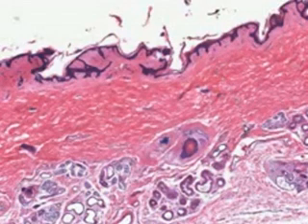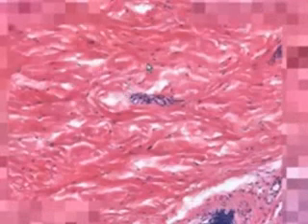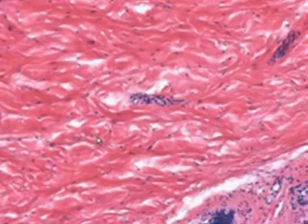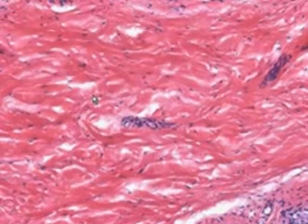The reticular dermis is this thicker, denser collagenous connective tissue in which you can see clearly dense collagenous fibers and fibroblasts. In addition, if you were to do an elastic stain, you would see that the reticular dermis is loaded with elastic fibers, which you can't really see on a regular H&E or hematoxylin and eosin stain. And of course, there are no significant elastic fibers in this papillary dermis here.